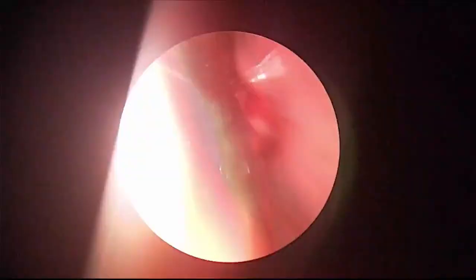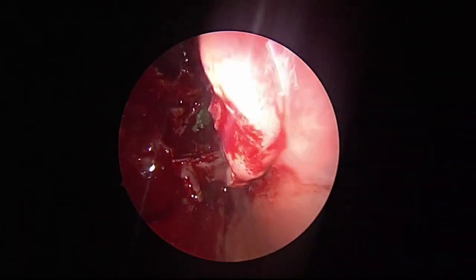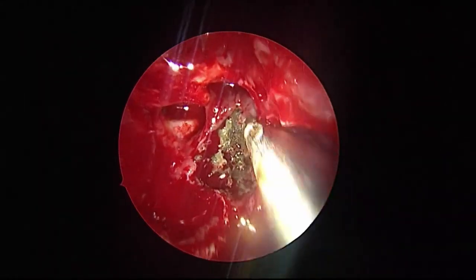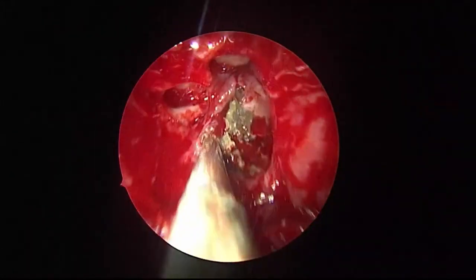What is it? See the sphenoid, how full it is. Now my optic nerve is in my view.